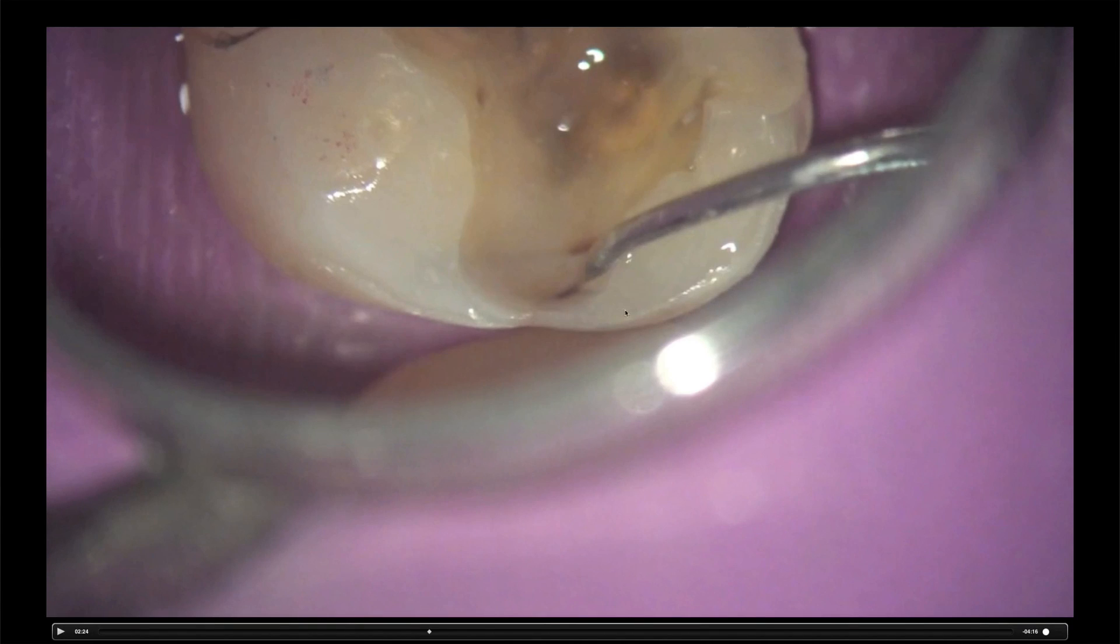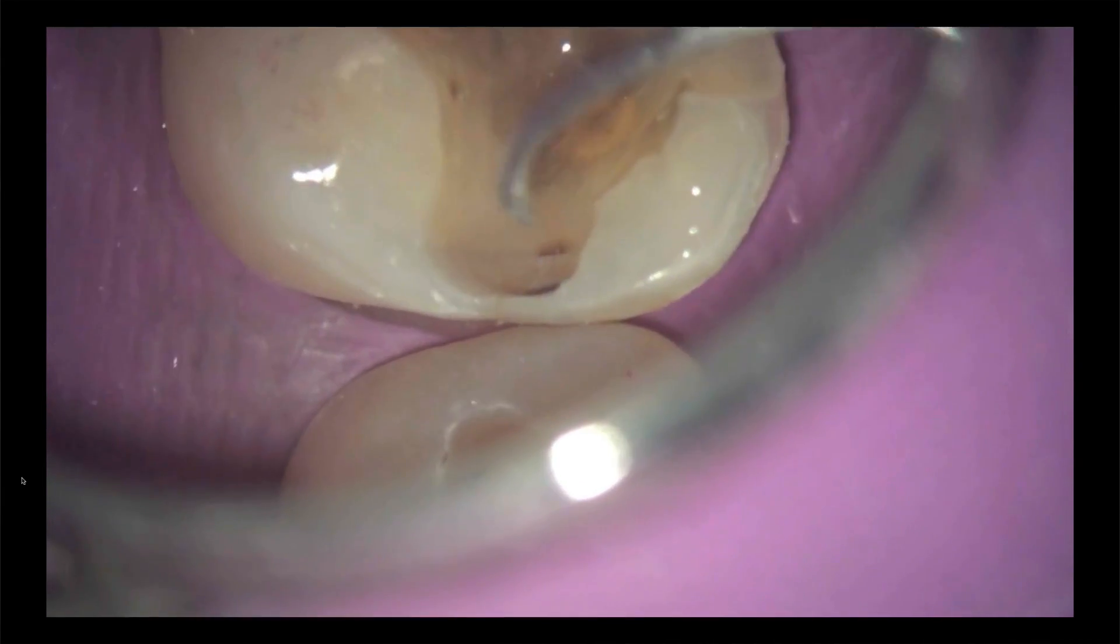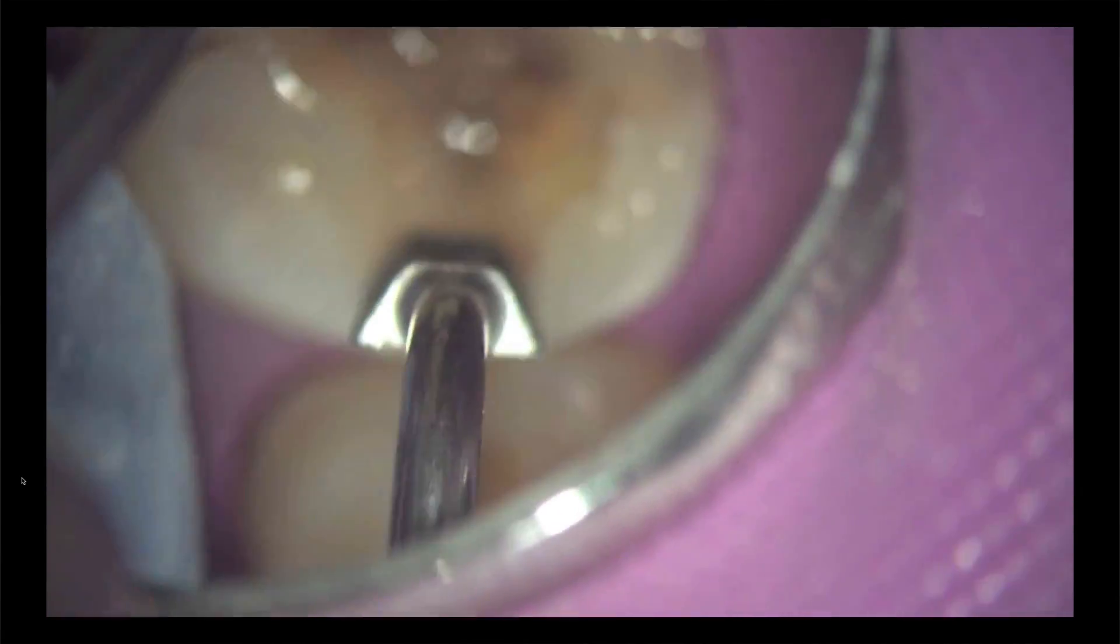There's some decay on the mesial, the buckle portion of the box or the contact here. So I'm going to have to prep this a little further, but I want to keep it as conservative as possible. So I'm going to try the instrument in first, the sonic prep tip in first, and then see how much I need to prep this with the rotary instrument, which I'll use a KS zero. So you can see there we've got caries. We're going to try in the sonic preparation tip. This is an opposite tip to the one I used on the distal. Obviously I had to switch it out. You can see it needs to be slightly wider. Plus I want to extend this to the buckle anyway, because of the caries.